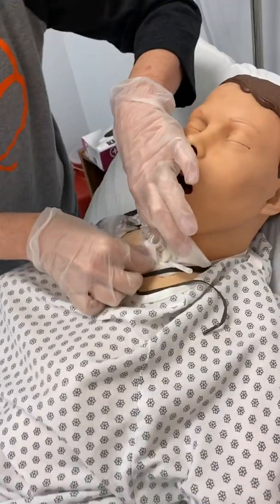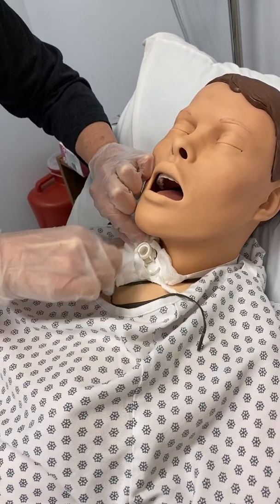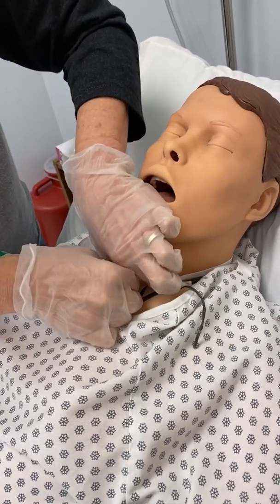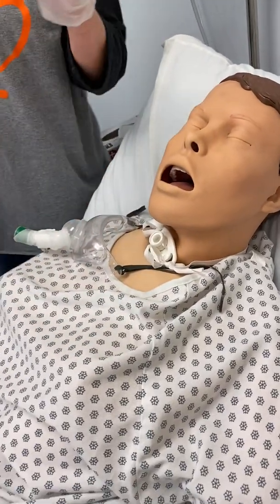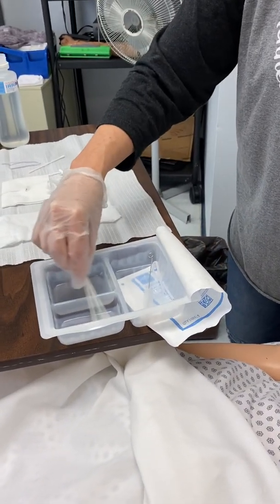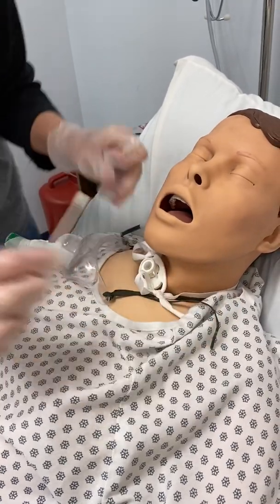Now I'm going to take off the gauze from under the patient's neck for the faceplate of it. Well, it's easier said than done. There we go. I want to be sure not to pull on that too much. And I'm going to throw this one away. Pick up 3 of my Q-tips. I'm going to dip it in my 3rd basin. And I'm going to clean around and under it with 1 swab.